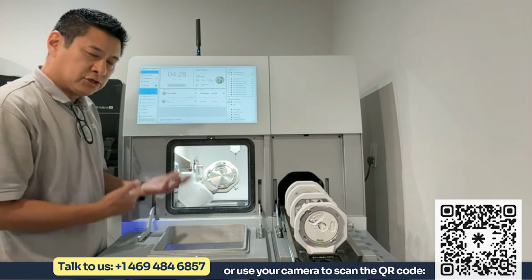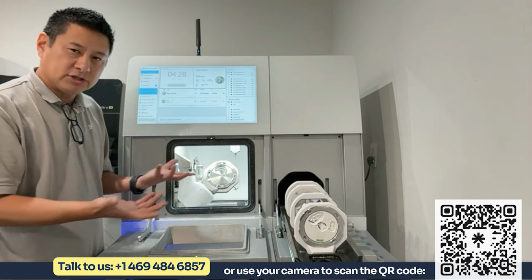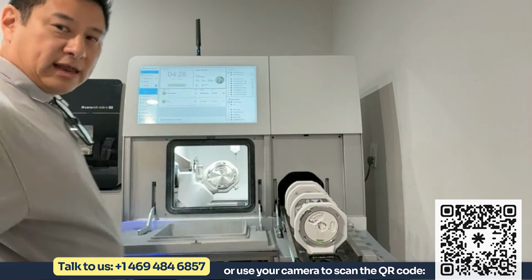So from a potential standpoint, I would say this obviously has much more potential than the Motion 3, but again, it's also a little bit more expensive, right? So automation, potential, strength.